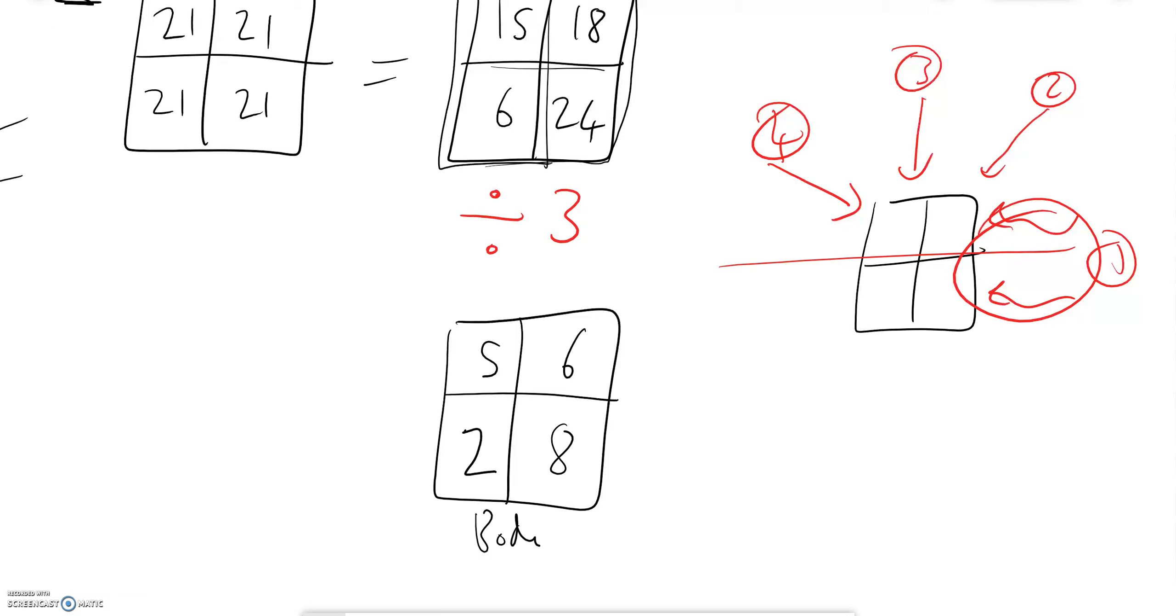And if you remember, that was the original densities of our body. So you can see how the computer would do this very quickly, following an algorithm. And it can calculate the original density of the body. And therefore we can spot that actually this is much denser than this. Why? Well, perhaps we can investigate that further. But remember, the body is divided up into millions of these three-dimensional voxels. Millions and millions of them. The whole body. And that's how CT or CAT scans work.